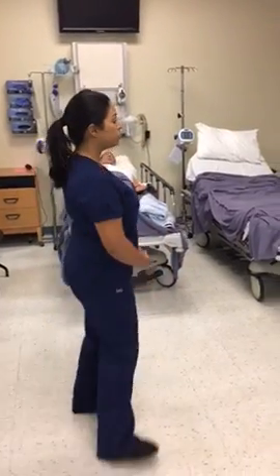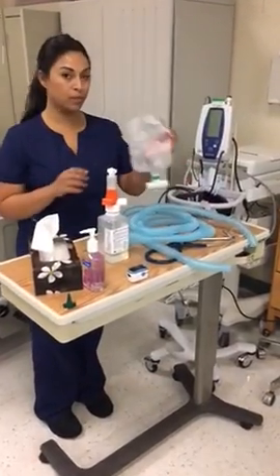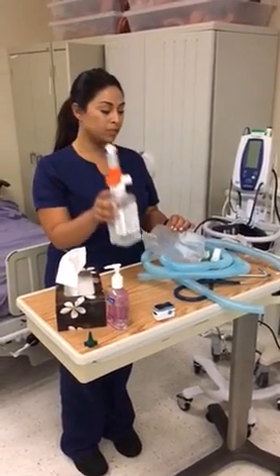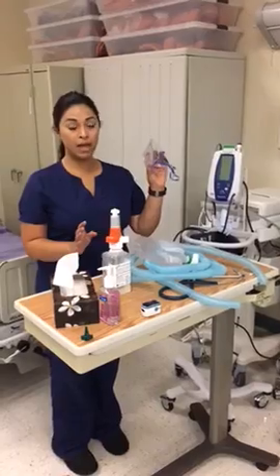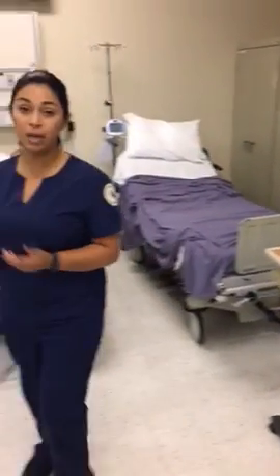Next, I want to gather my equipment, so I'm going to need corrugated tubing. I'm going to need a water trap, a large volume nebulizer, and an aerosol face mask. So next I'm going to prepare to enter my patient's room.